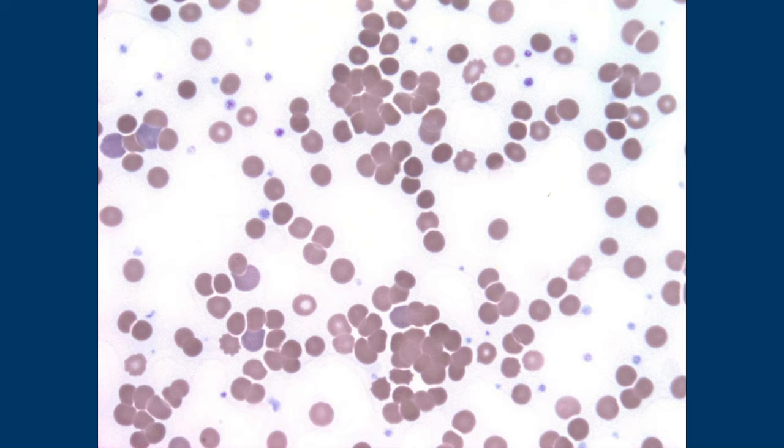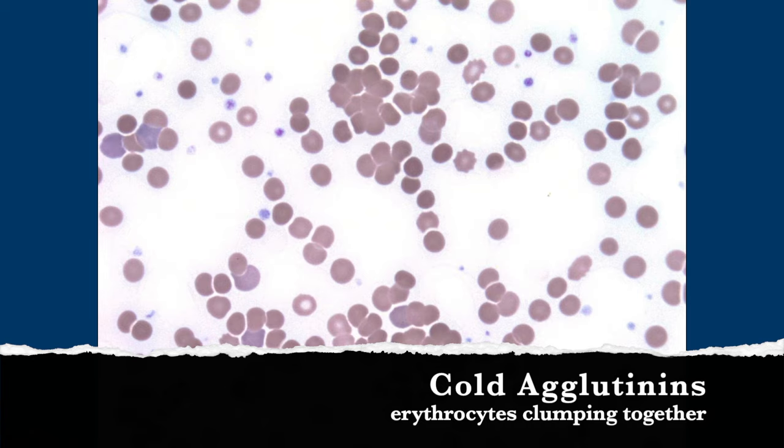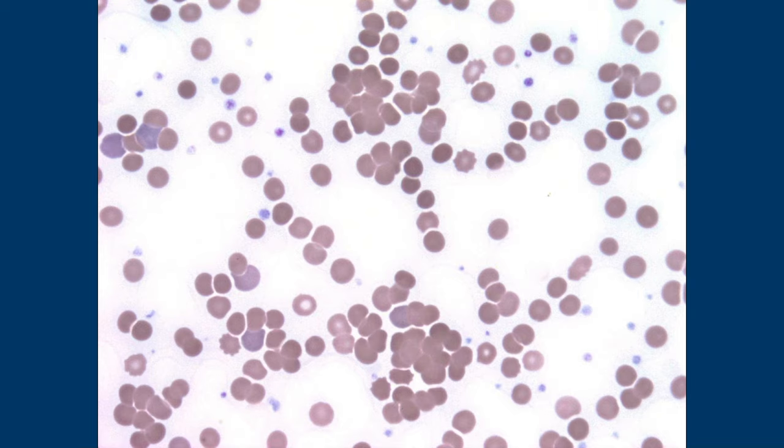The red cells seem to clump together here — and there seem to be more platelets than usual. These are cold agglutinins because the red cells are agglutinating. The lab has a warming procedure — they'll give me a slide pre-warmed and a slide post-warmed. You'd expect the agglutination to resolve or mostly resolve with the warmed specimen. Cold agglutinins are antibody-mediated — when exposed to cold, the red cells agglutinate.